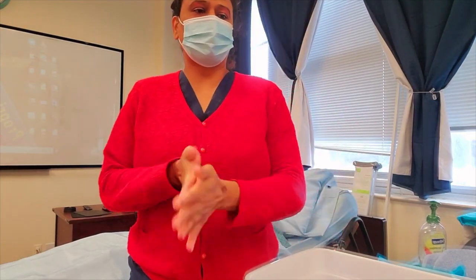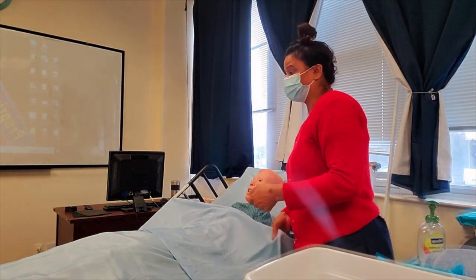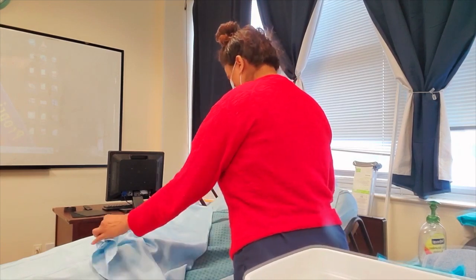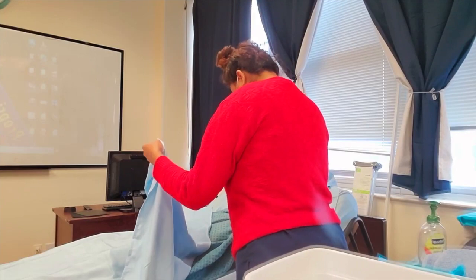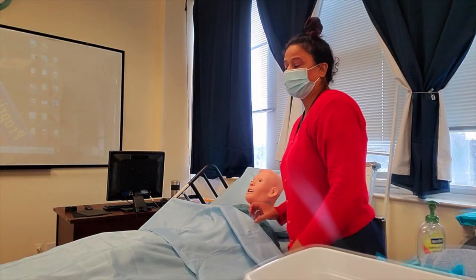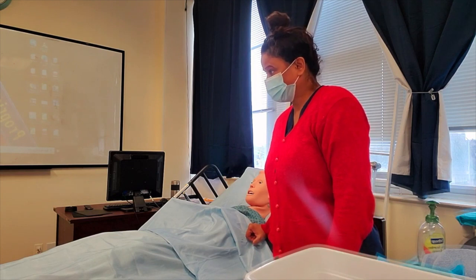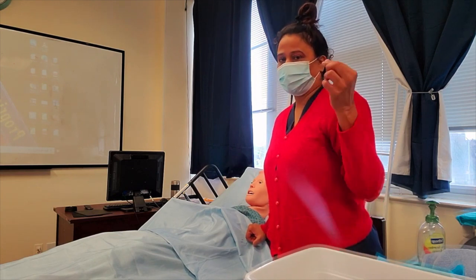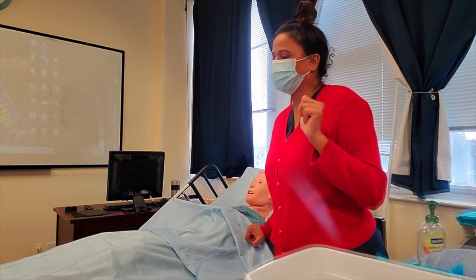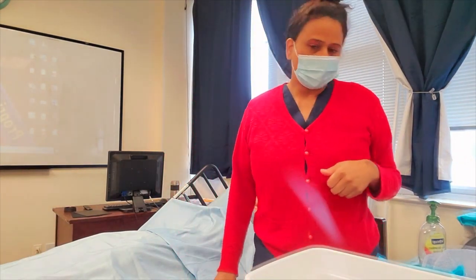You wash your hands for 15 to 20 seconds and come back. When you return, the next thing you want to do is identify your patient — make sure it's the correct patient. Hi Mrs. Jones, how are you? You check the ID band and ask for her date of birth. She gives you her date of birth and you check the ID band. Those are the two forms of identification.